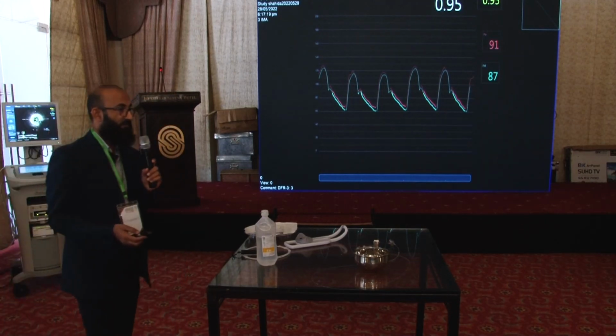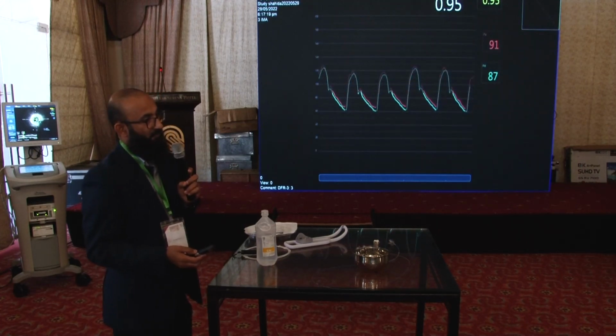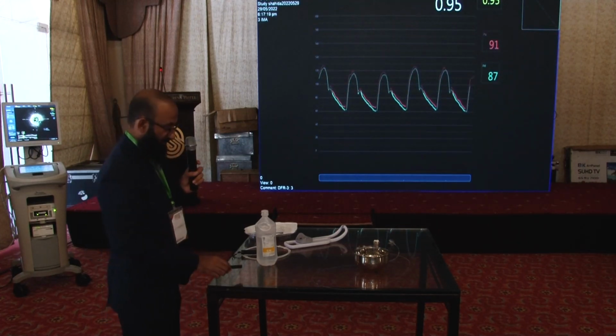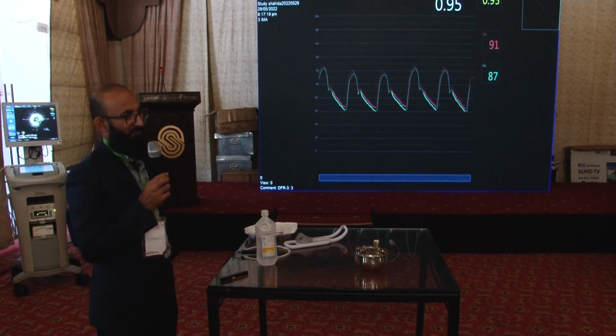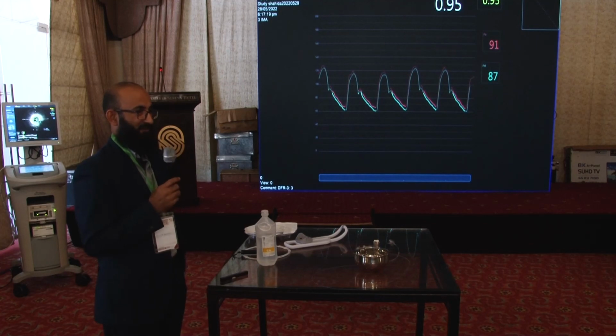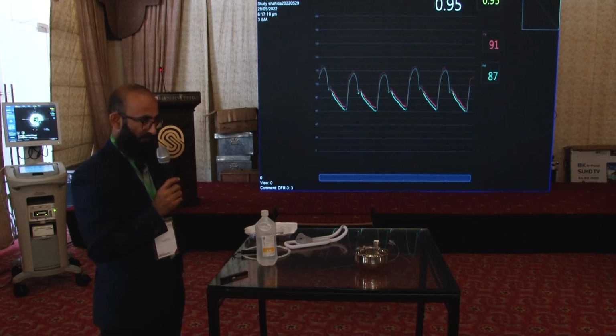Sir, please. What's your experience regarding the comparison of iFR and FFR? Sorry, qFR and FFR. We don't have qFR. We practically don't use it. We are trying, we are looking for it, but we don't have qFR.